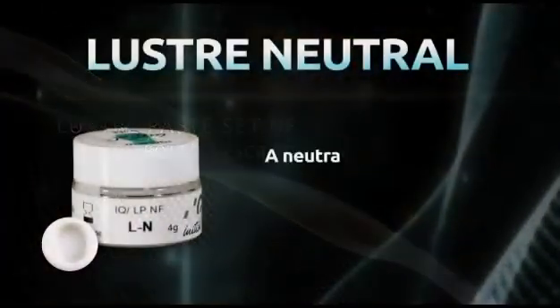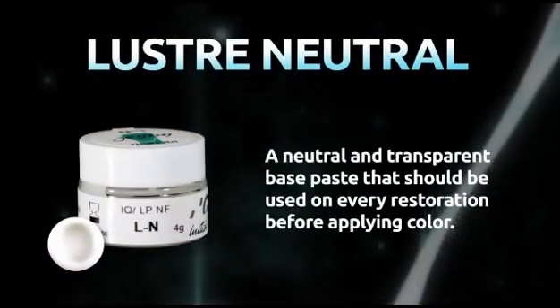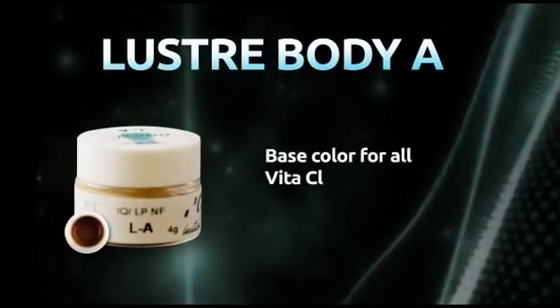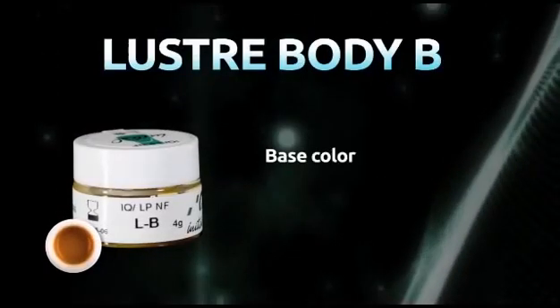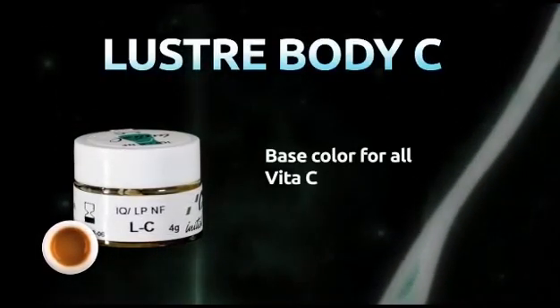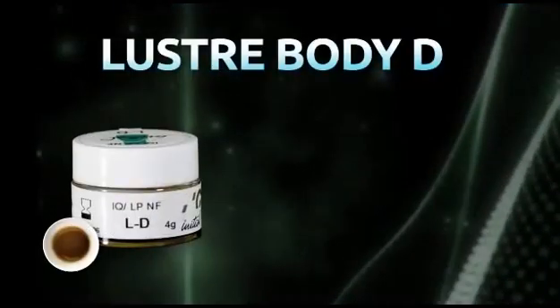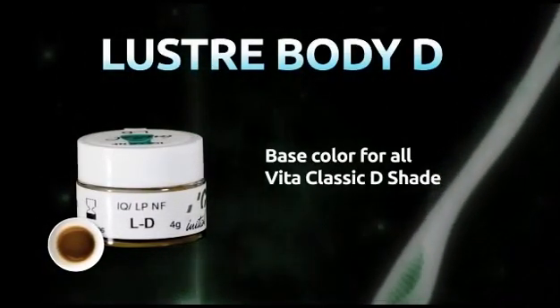Lustre Neutral: a neutral and transparent base paste that should be used on every restoration before applying color. Lustre Body A: base color for all Vita Classic A shades. Lustre Body B: base color for all Vita Classic B shades. Lustre Body C: base color for all Vita Classic C shades. Lustre Body D: base color for all Vita Classic D shades.